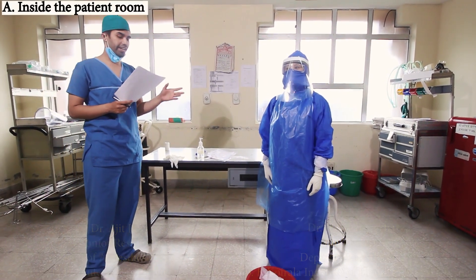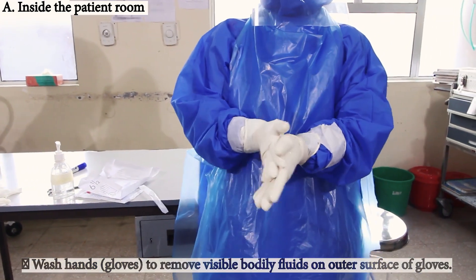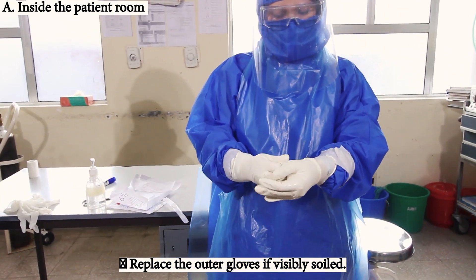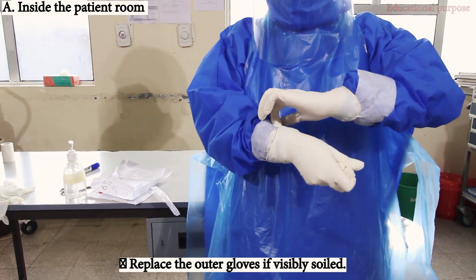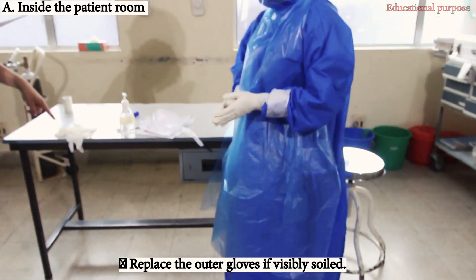First, in the patient room, wash hands to remove any visible body fluids on the outer surface of the gloves. Replace the outer gloves if visibly soiled. We have removed the soiled glove and will replace it with another one.